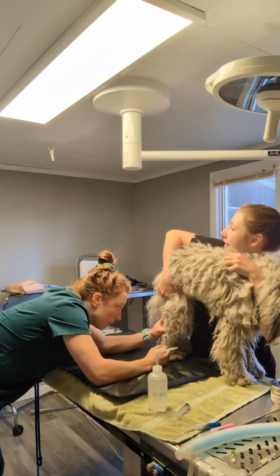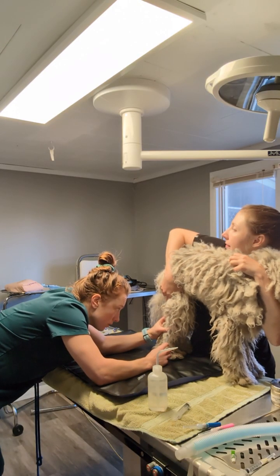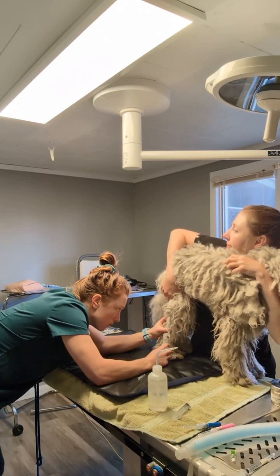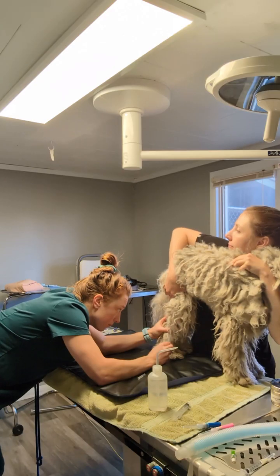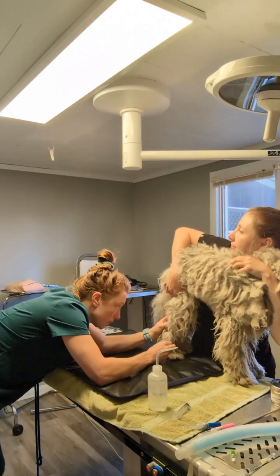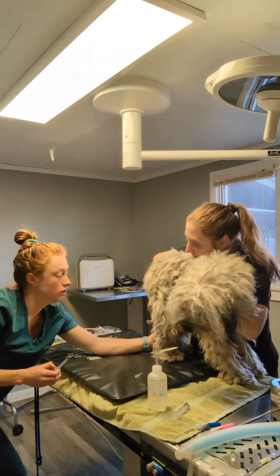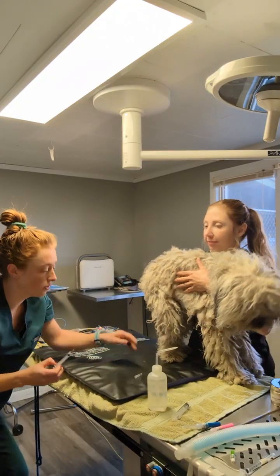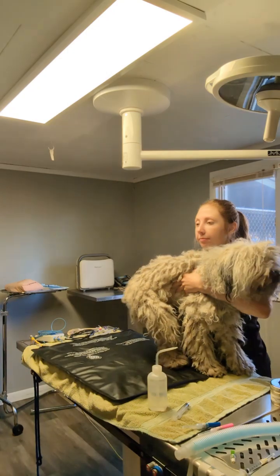All right, and just going to hold off that vein. Jackie's going to take over holding it off, and then we'll just secure her.